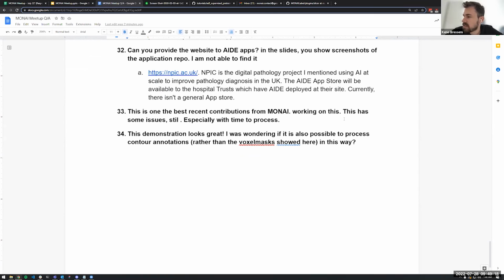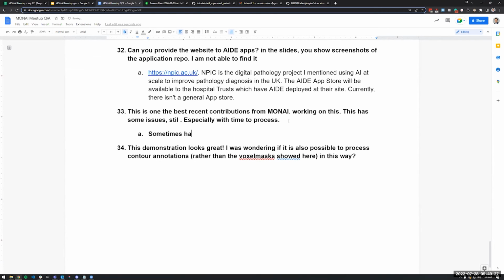So we found out that you have to frequently clear the Slicer cache if you work with Slicer. It just fills up and it takes longer and longer and longer to load the images. The beginning is very fast, but after 500 images, it was 1 minute loading time, and just clearing the Slicer cache will solve that issue.